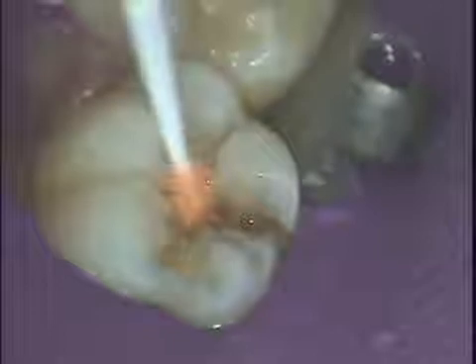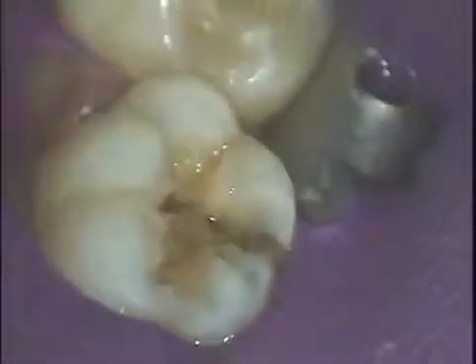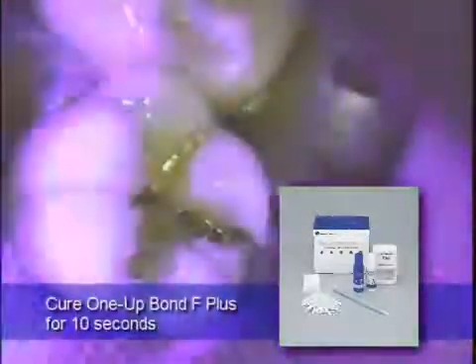Then, 1-Up Bond F Plus is applied and scrubbed on the tooth surface for 10 seconds. If required, additional 1-Up Bond F Plus can be applied to the cavity preparation. The 1-Up Bond F Plus is then light cured for a total of 10 seconds.